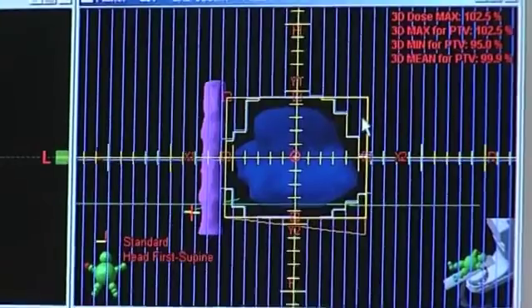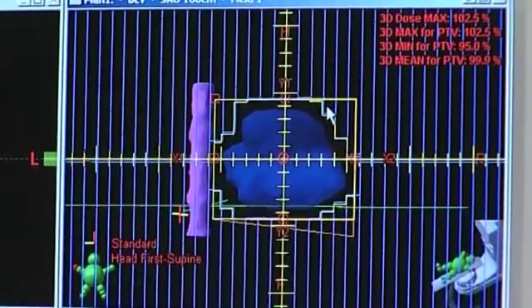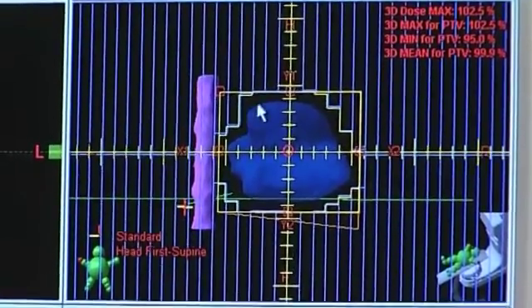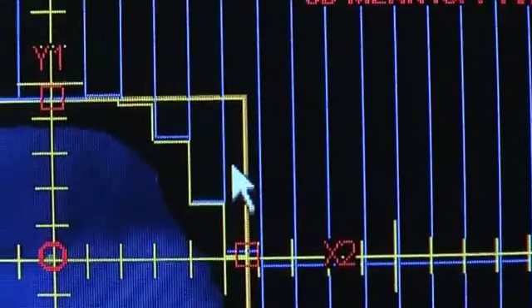As you can see, the PTV here is a specific shape. If we applied this field only without any shielding, we would be treating this normal tissue here.